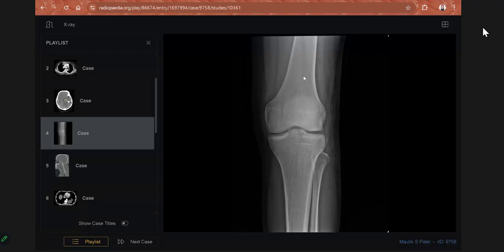Sir, I am provided with a radiograph of the knee of a skeletally mature patient, and the first obvious abnormality I could appreciate is a small fracture fragment adjacent to the lateral tibial plateau, likely representing a Segond fracture. In addition, I could appreciate mild lucency in the tibial spine, and as I know that the Segond fracture is closely related with avulsion of the ACL, I would like to confirm this on MRI to see any possible ACL injury and would like to take an orthopedic consult.